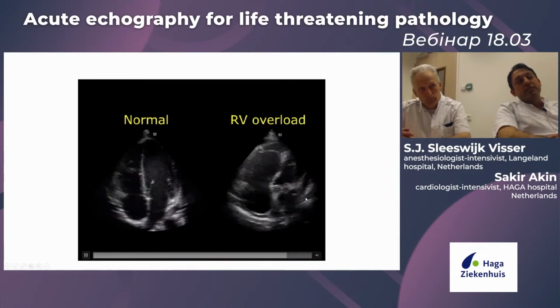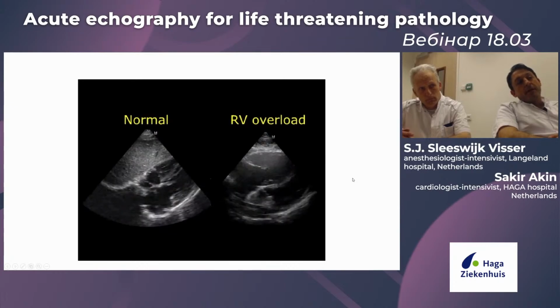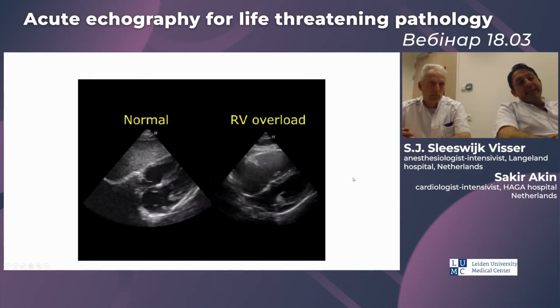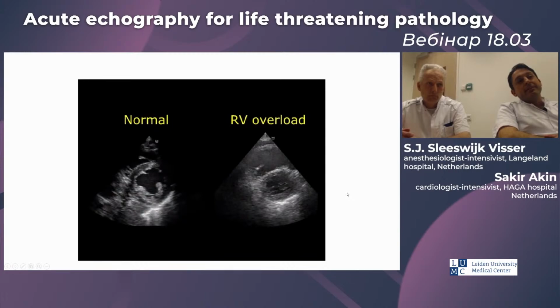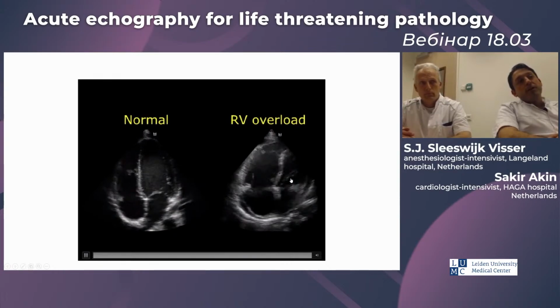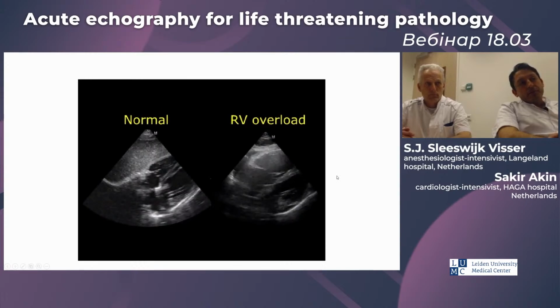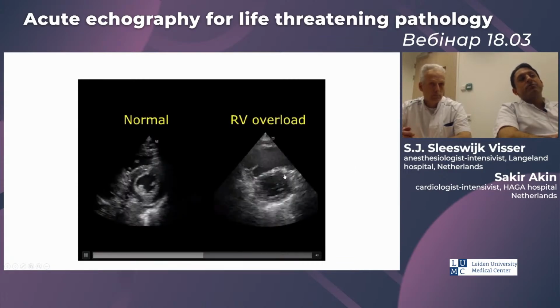And you will see at the end, if you go on filling this patient with fluids, you will get more problems, with both a diastolic and systolic D sign. So you will get more severe shock if you have inadequate filling management in these patients. So be aware of the problems of giving fluids to these patients with already high right-sided pressures.